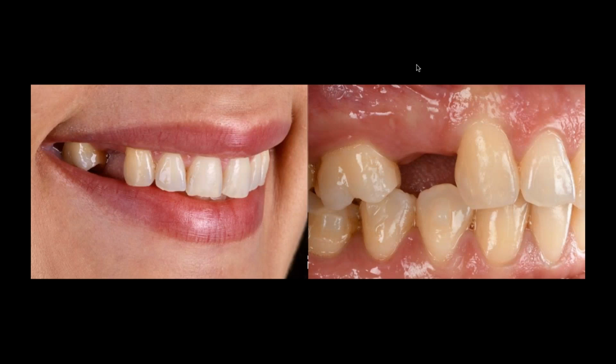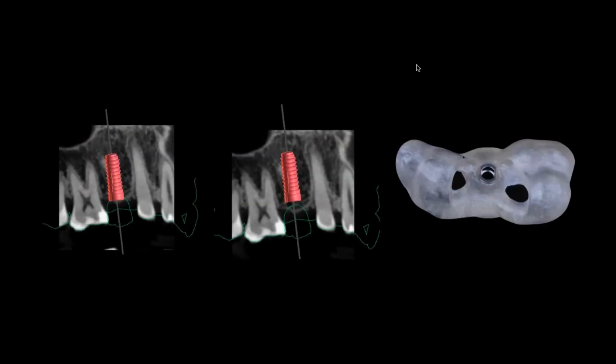So I want to go through some of the basics when we are treatment planning on implants. Where would I place the implant? At the bone level, or subcrestally or supracrestally? And we always need to first consider the prosthetic aspect. So we always make sure that when we're planning, we merge the STL of the digital wax-up, as you see here in green, and from there we would decide the final implant position. So always we need the platform of the implant to have 3 millimeters of soft tissue coronally to be able to maintain that bone at the crest. Okay, so this workflow helps us decide where my implant needs to be placed. Not only the bone condition, but the future marginal position.